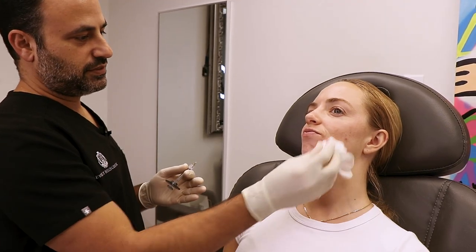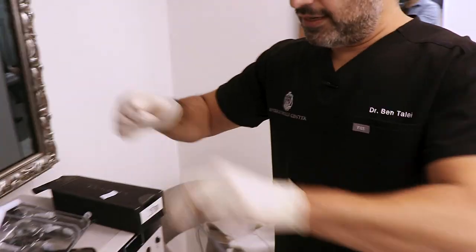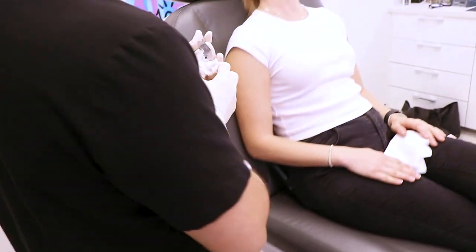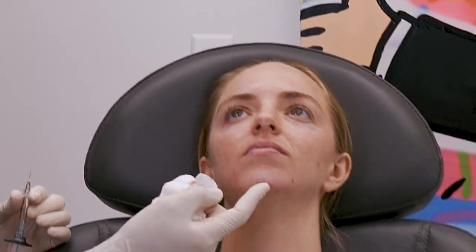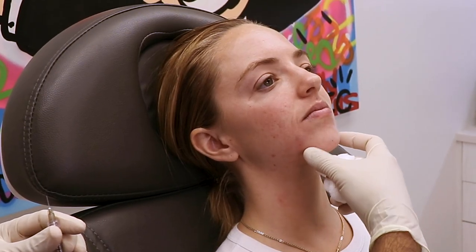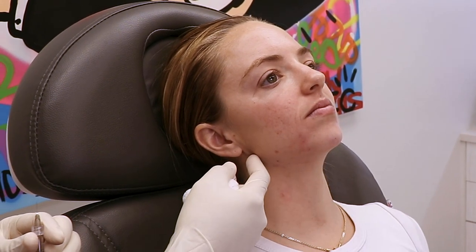That's one syringe used to correct this entire area. Now we go to the jawline. The jawline is interesting because most of it corrects already once you do the pre-jowl sulcus and the chin. So you always do the pre-jowl sulcus and chin first, then move back to the jawline.